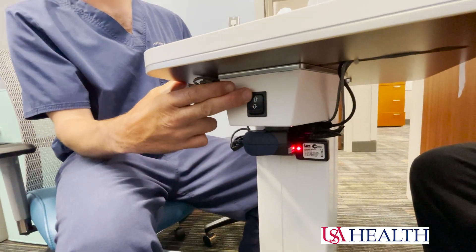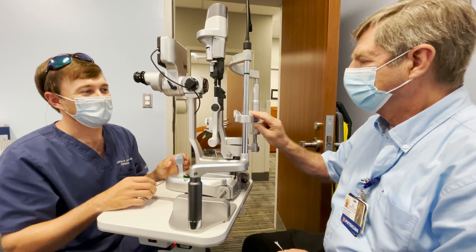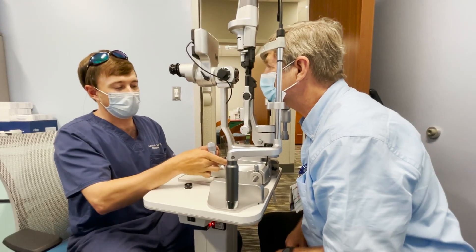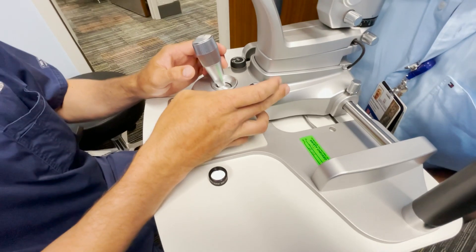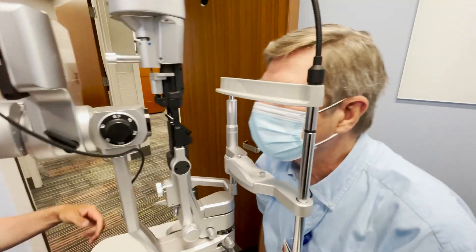We're raising the slit lamp up, cleaning it with an alcohol pad first. Then we turn on the slit lamp with this knob here — the power button — which also changes the intensity of the light. The lower the intensity, the better in terms of patient comfort.